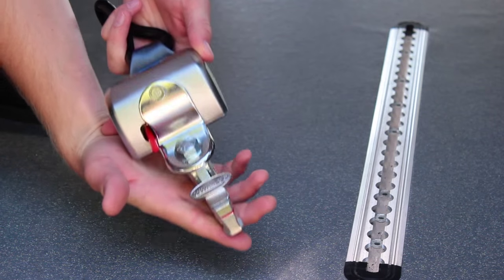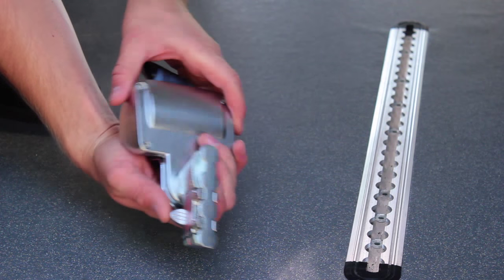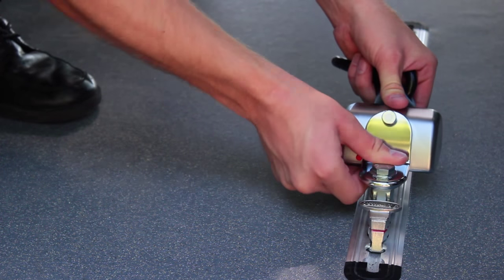To install a tie-down restraint, align the grooves with the grooves on the floor. Press down and slide over. It's that easy.